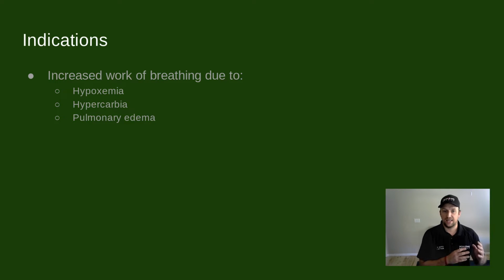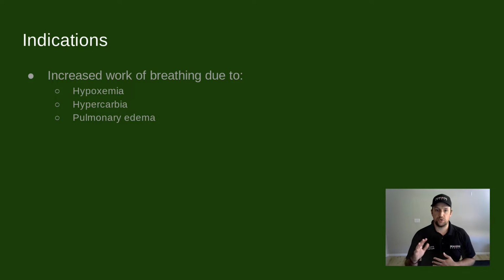I want to tie in the shortness of breath approach video here. These are the people that are in extremis. So they're on the line between needing intubation and not needing intubation. BiPAP can absolutely turn them around. Hopefully by the end of this video, you'll feel more comfortable about doing BiPAP trials or applying BiPAP to anyone that you think needs it.